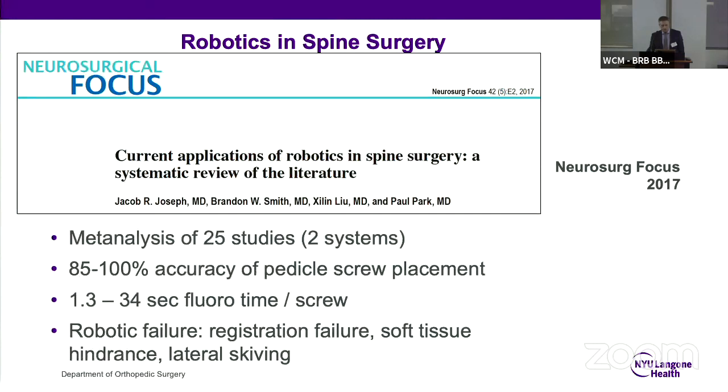So there's a significant savings. I mean, obviously, if you do it freehand open and you don't get a preoperative CT, that's the lowest amount of radiation exposure to a patient. But you have to think about not only your patient, but yourself and the staff around you. And I can tell you that our staff are much happier in the navigated rooms than the fluoroscopic rooms.